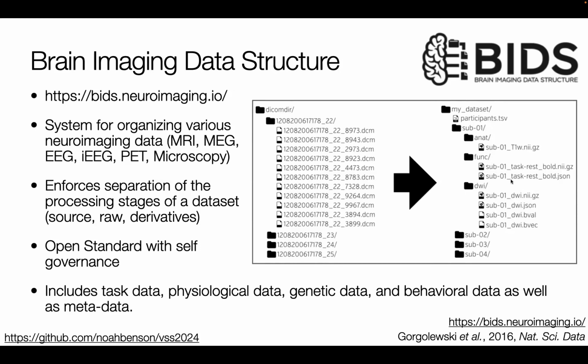It has a lot of really nice features. It's an open standard with self-governance. It lets you track task data, physiological data, genetic data, behavioral data, metadata, as well as your actual scan data. It's got ways to format all that.